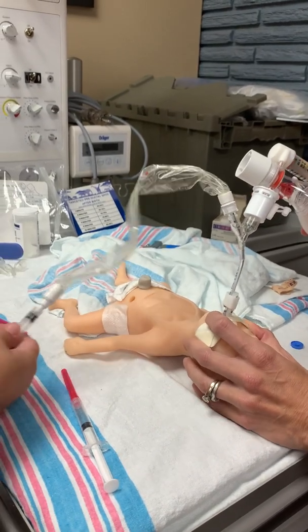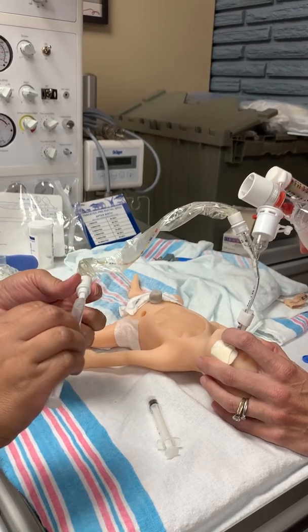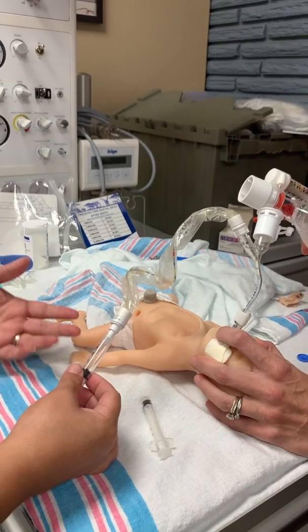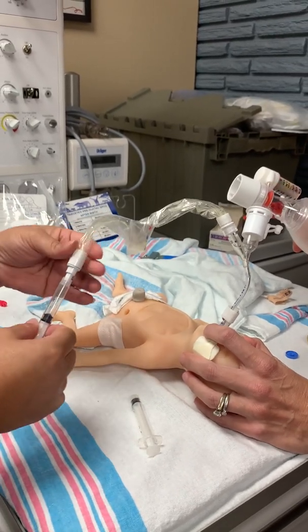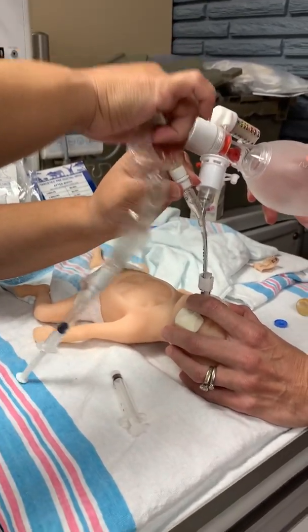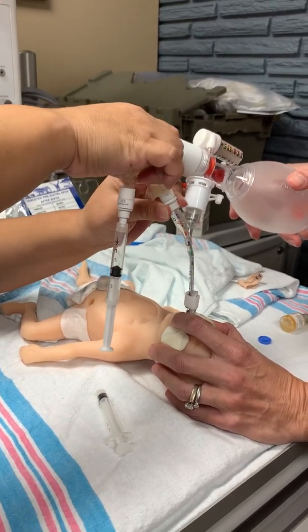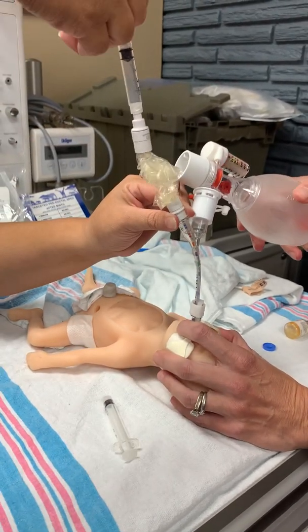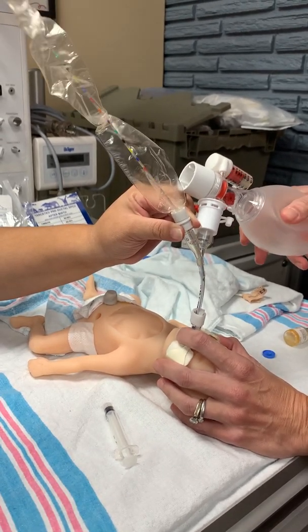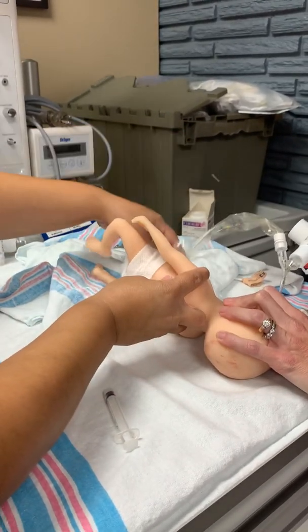And now I'm going to attach my second aliquot, or my second dose here. And we're gonna do the exact same steps, but now we're gonna turn to the right. So again, surfactant's here with my air bolus. Going to advance the catheter in, matching them up again, 15 to 15. Provide my bolus. Remember to pull my catheter out and then turn head and body together.